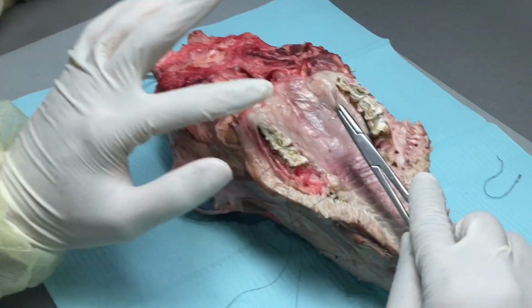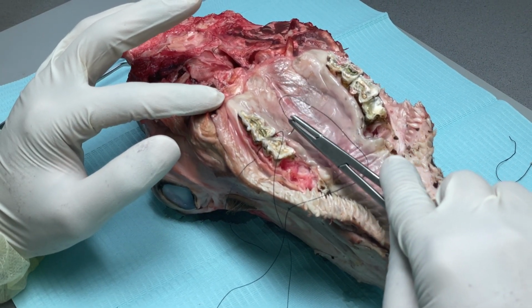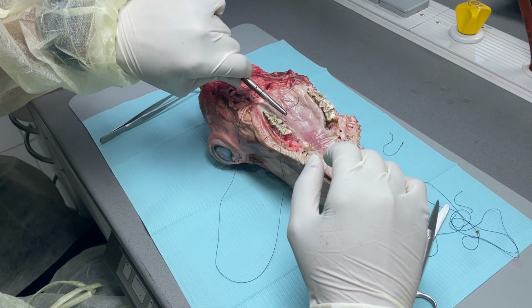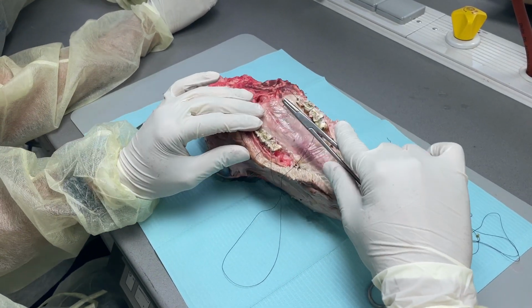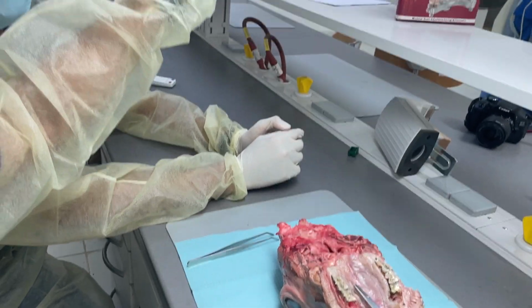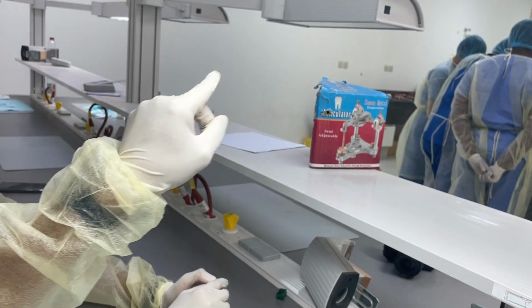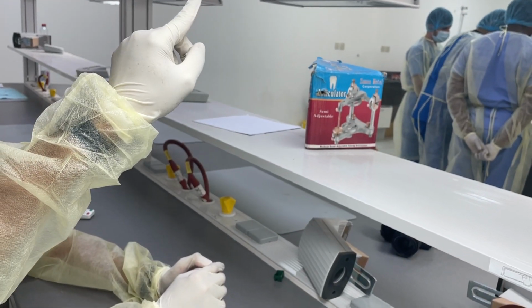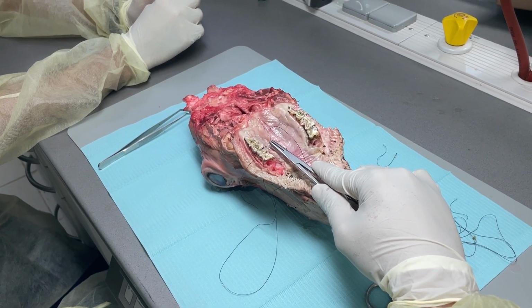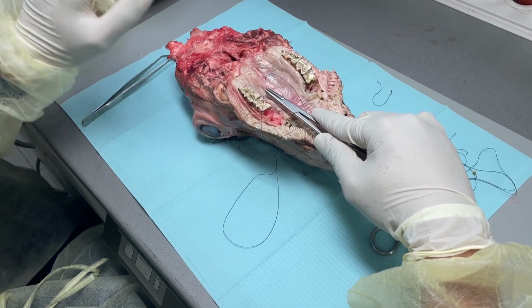I entered from here, same like the simple interrupted, but the second bite I am taking from the external surface. In the earlier one I took it from the internal surface. In this I will take it from the external surface. If you see, imagine it came like this, then it is coming like this. So you see it is an 8. Whereas the other one came like this and came back. It's a simple loop.